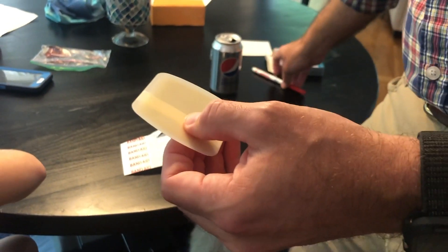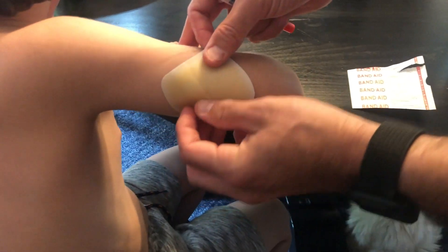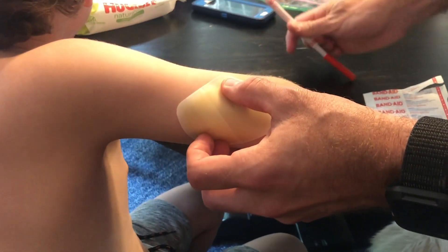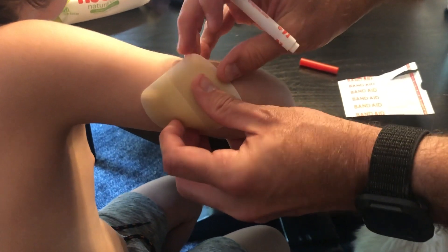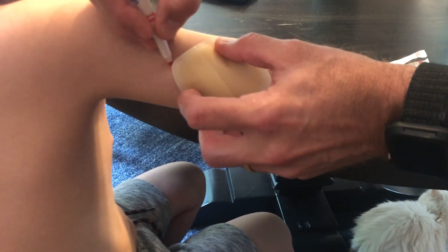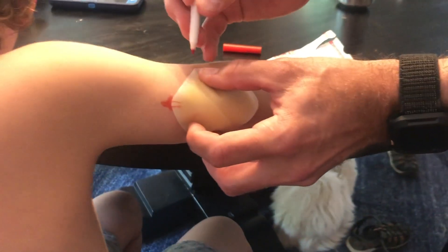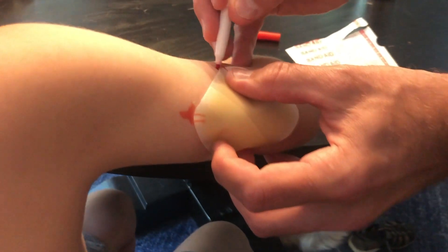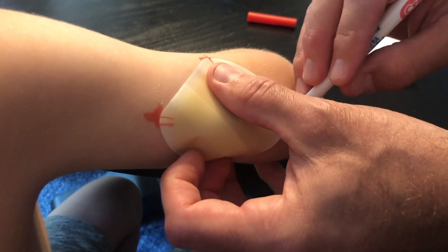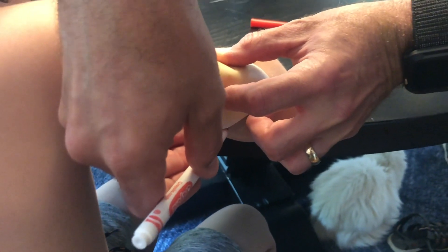To put it on the skin, I kind of set it down where I want it — right here on the back of the arm, which works well for us. Then I mark it with this little crosshair so I know exactly where it's going to be and how to line it back up after I've prepped the area.